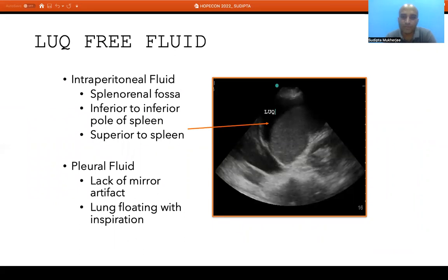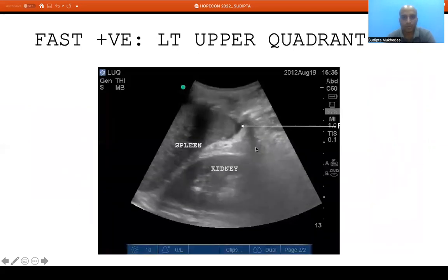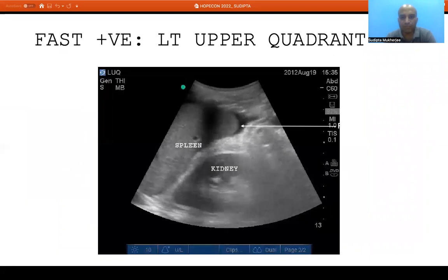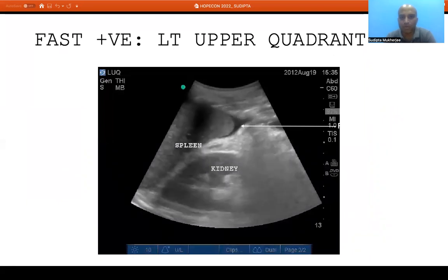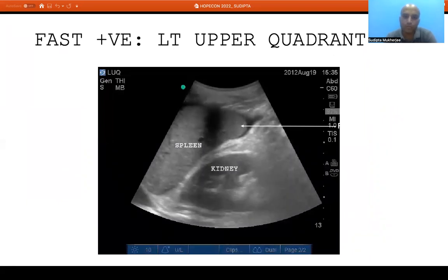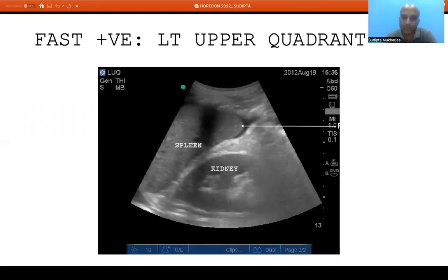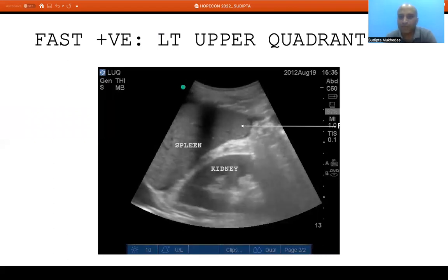A real-time left upper quadrant image can show free intraperitoneal fluid just below the diaphragm, in the splenorenal fossa, inferior to the inferior pole of the spleen, and superior to the spleen in the subdiaphragmatic area — along with pleural fluid and a lung floating within it. If we see a small amount of fluid at the lower pole of the spleen, we describe it as left upper quadrant FAST positive.